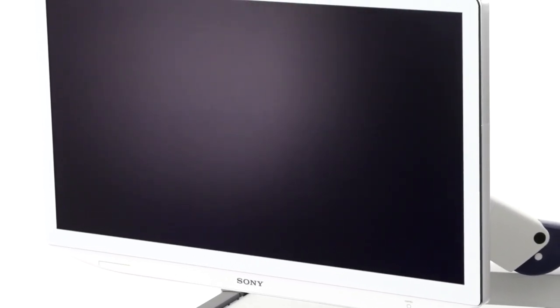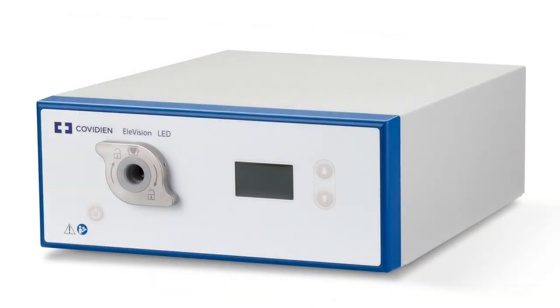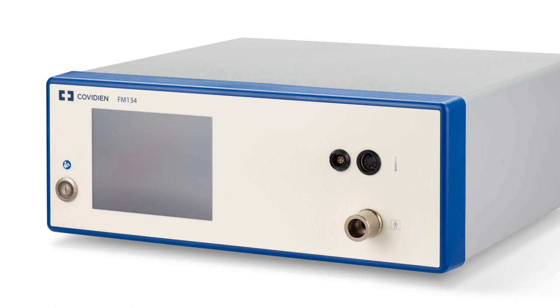To start, I'll walk you through getting the cart set up, adding components, and connecting them. I'll start with the monitor and CCU, then add your light source. Next, I'll show you how to connect the MetaCapture and the printer. I'll finish with the insufflator and pump.